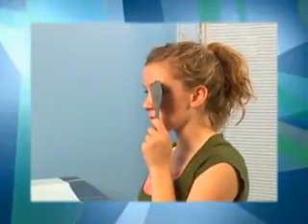Ask the patient to cover her left eye with the eye occluder. Since this patient wears glasses, she should be told to place the occluder in front of her glasses gently to avoid moving them from their normal position, as this can cause inaccurate test results. If the patient is not wearing glasses, the occluder is simply placed over the eye not being tested.